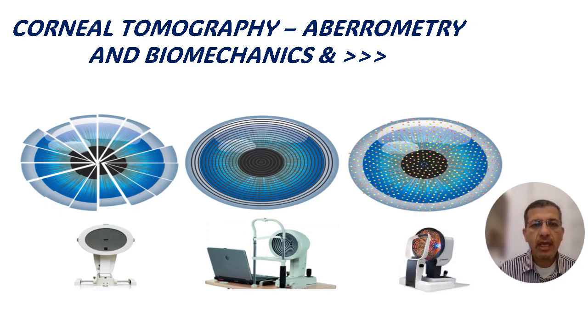I will try to give new concepts, new principles and new ideas about topography and tomography, and I will avoid the basic interpretation of the topography maps, as I'm sure that all of you know the basic principles of interpreting the topography map. However, I will concentrate on certain important new points that I would like to share with you. I hope that you will benefit from this information and find it useful in your daily practice. Now let's dive into this lecture.